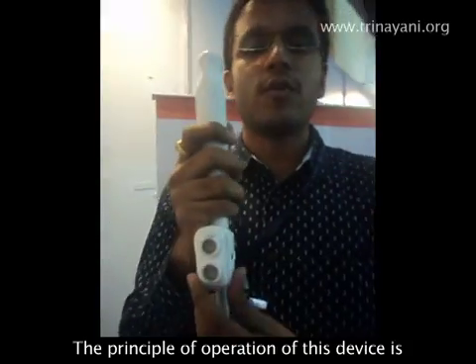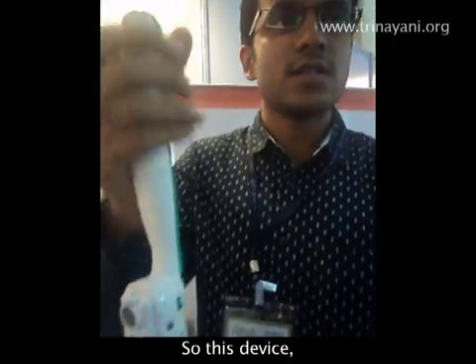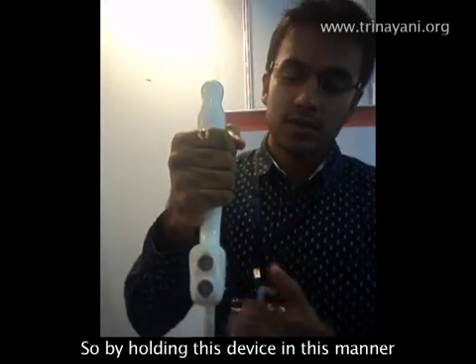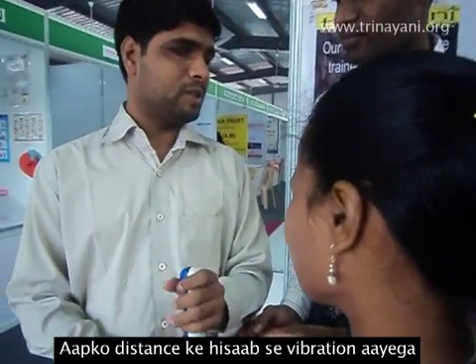The principle of operation of this device is that it provides ultrasonic vibrations. By folding the device in this manner, it provides vibrations to your hands. From this you can sense it — you can feel the vibration as well.